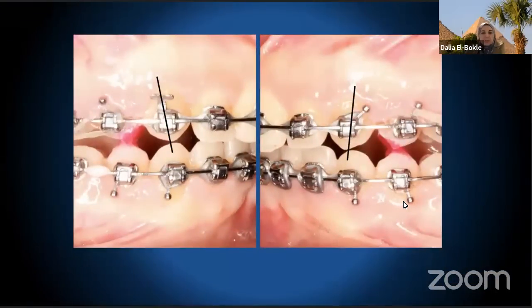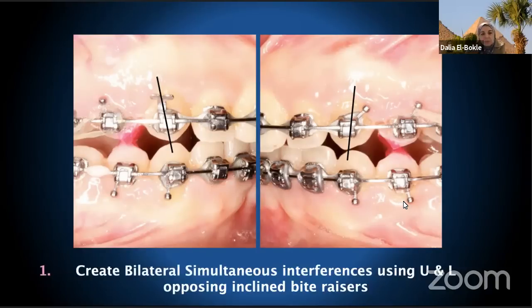So the concept here is I am applying the bite tables on the upper and the lower. So when the patient bites, there is a premature contact. It's a deliberate or intentional premature contact. And I am actually training and forcing the patient to move the lower jaw forwards by the use of the inclination in the bite tables in order to achieve a bite of comfort.